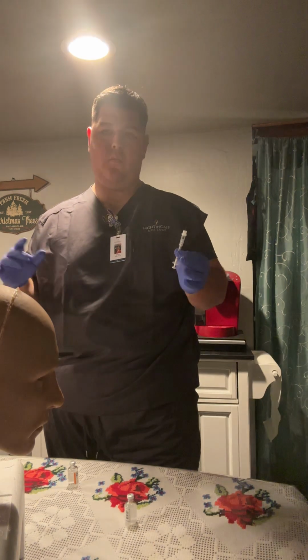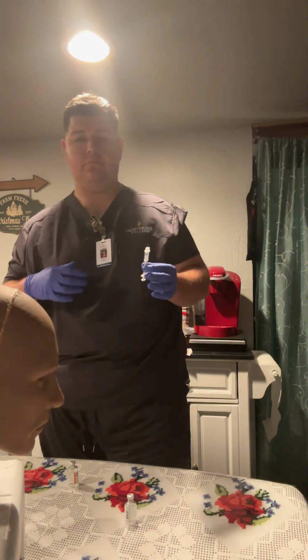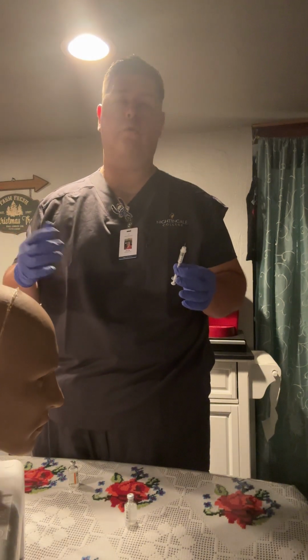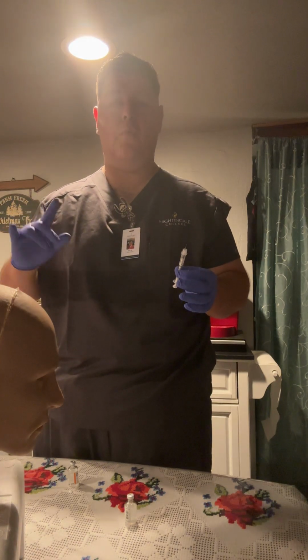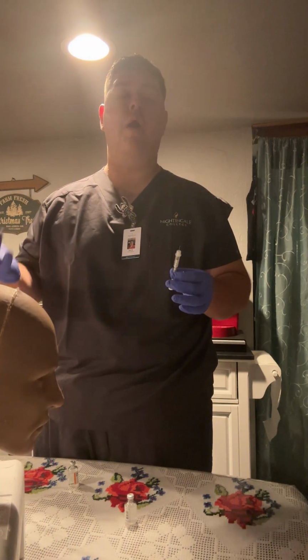So I don't want to add this to the other vial. I want to just draw it up. And additionally, I want to ensure that I don't overdraw. So, sorry, a little brain fart there. I don't want to mix them. I just want to draw, and I don't want to overdraw either.